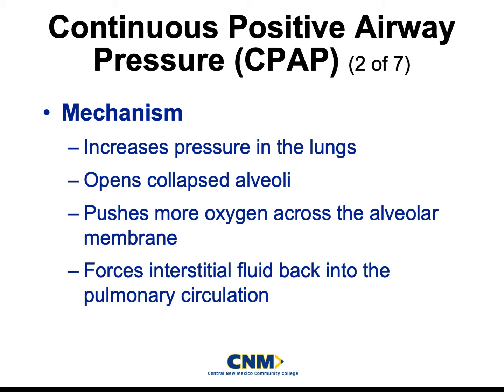But this will actually push fluid out of our way in order to recruit alveoli, and once we actually get that fluid out of the way, like I said, those alveoli are stented open for proper, adequate respiration or gas exchange at the alveoli level.